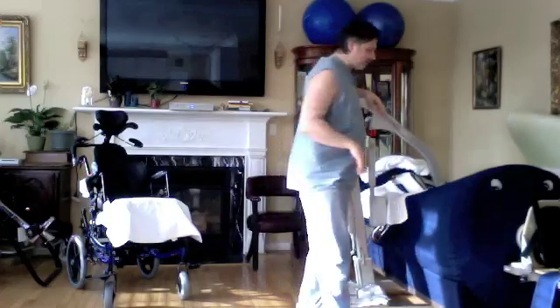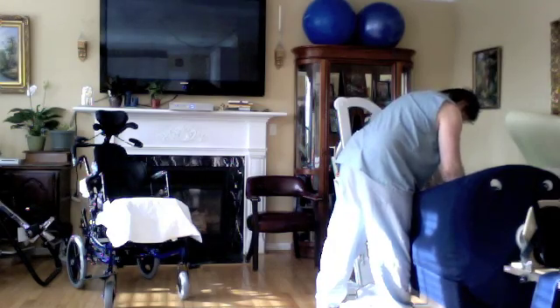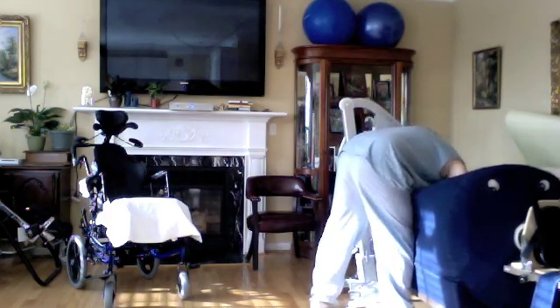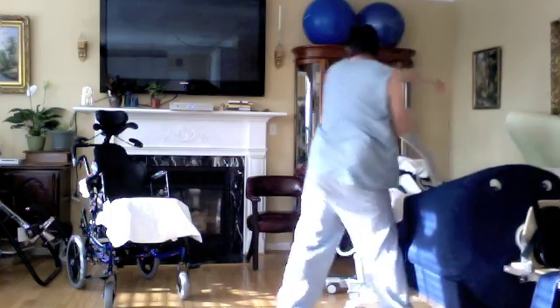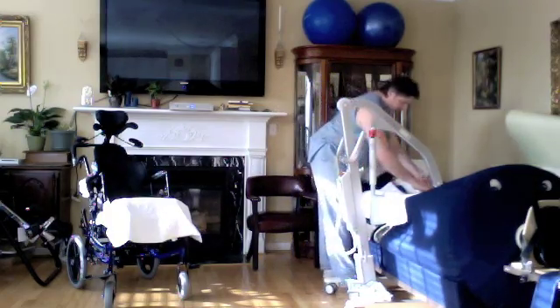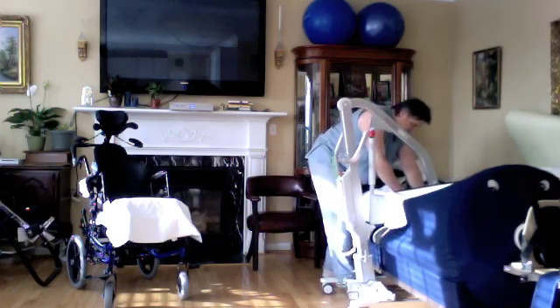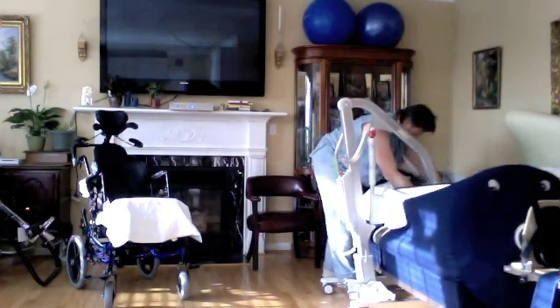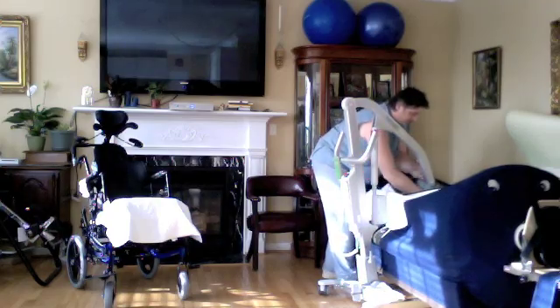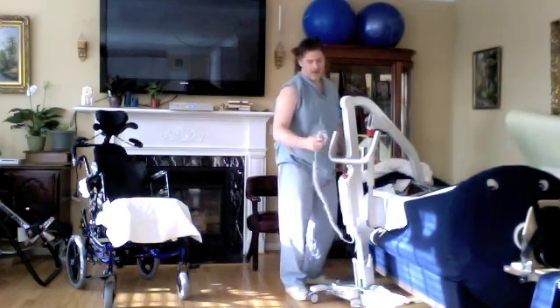And I'm going to swing to this side. First thing I do is get the 2 points that are down by his leg, and hook it on. And then the 2 points that come up around his shoulder blades. You'll see when I bring them out how it's almost like a swing. I actually put Carrie in it at the beginning of the week, and she said it's very comfortable, that she can spend quite a bit of time in it.